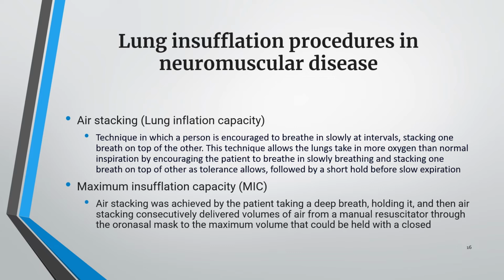So one is done passively just with room air in your mouth, and the other uses a manual resuscitator. Studies have shown that one is a little bit better than the other, but if you don't happen to have a manual resuscitator handy, the air stacking technique works rather well.